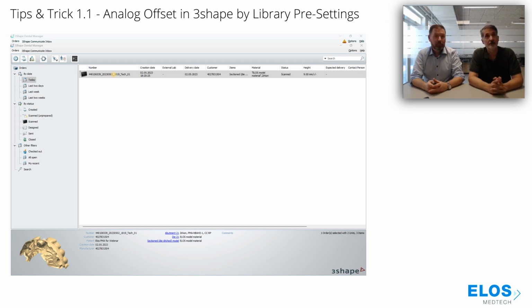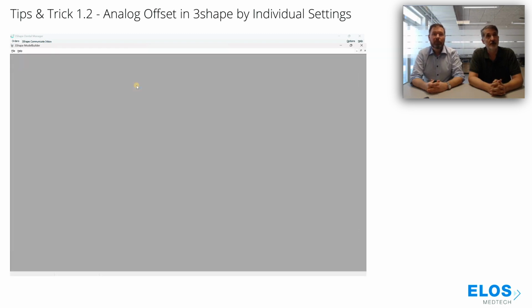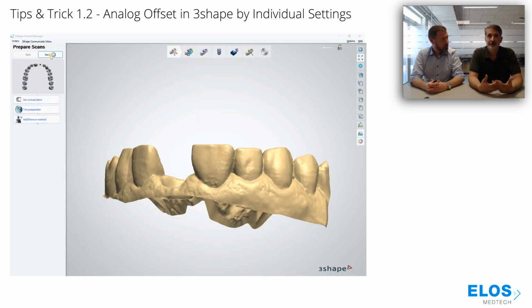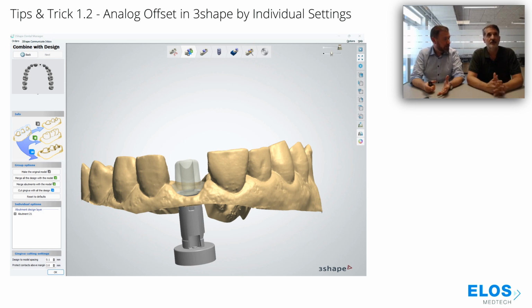If we go to the next sheet, we can see the model builder application. You can always modify the settings inside your model building process. So if you didn't select the right material file, you can do it here.